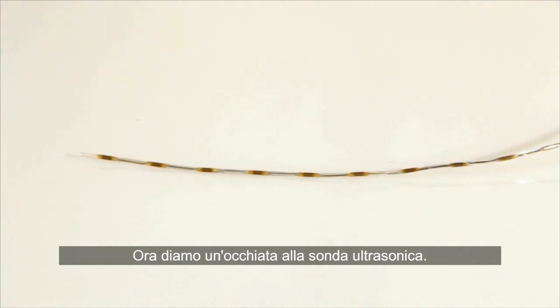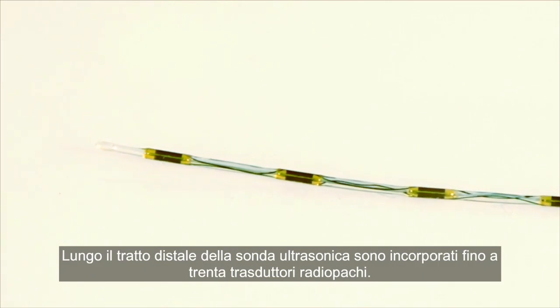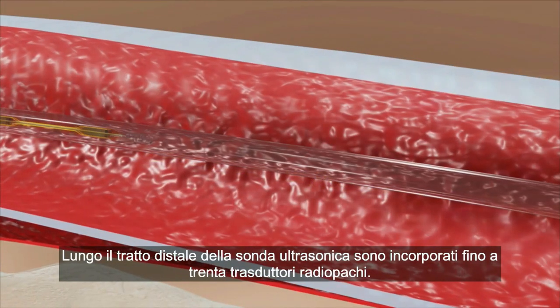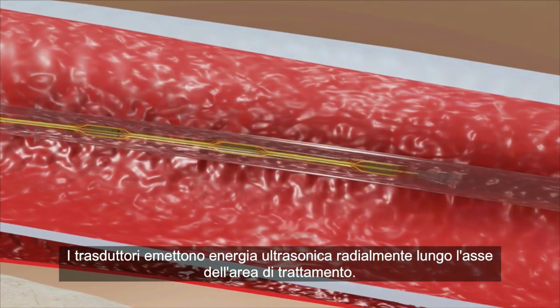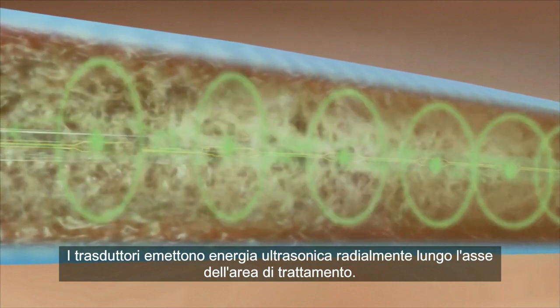Now, let's take a look at the ultrasonic core. The ultrasonic core incorporates up to 30 radiopaque transducers along the distal length of the core. The transducers emit ultrasound energy radially along the axis of the treatment zone.